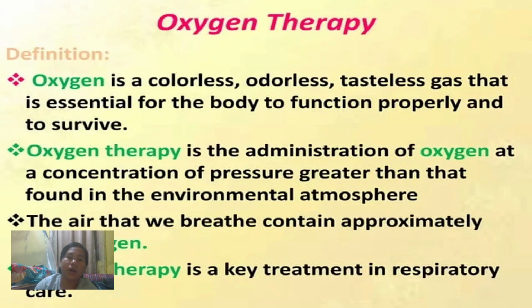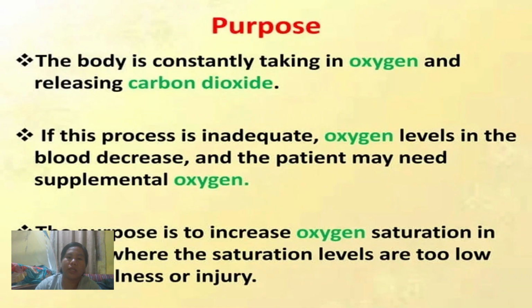Oxygen therapy. Oxygen is a colorless, odorless, tasteless gas that is essential for the body to function properly and to survive. Oxygen therapy is the administration of oxygen at a concentration or pressure greater than that found in the environmental atmosphere. The air that we breathe contains approximately 21% oxygen. Oxygen therapy is a key treatment in respiratory care.